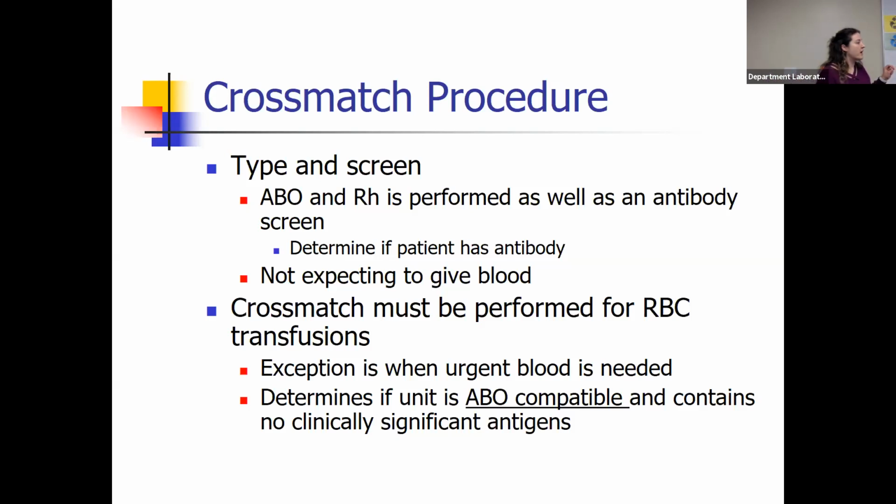Why is that? If you try to give an O patient an A unit, in the cross-match you're taking patient plasma mixed with donor red cells. What's in your O patient plasma? Anti-A and anti-B mixed with A red cells. What's going to happen? Your patient's anti-A is attacking those donor cells. It's going to give you a 4+ reaction at initial spin. Okay.